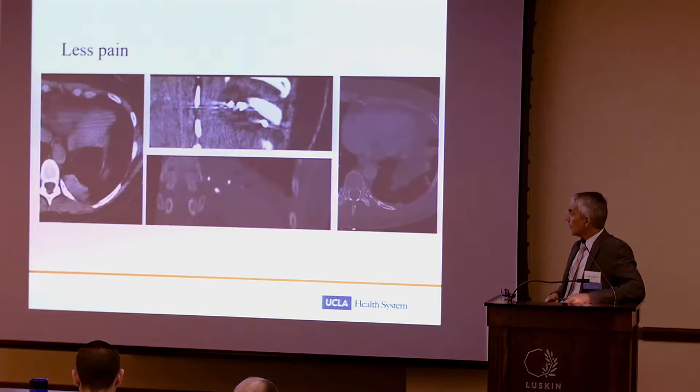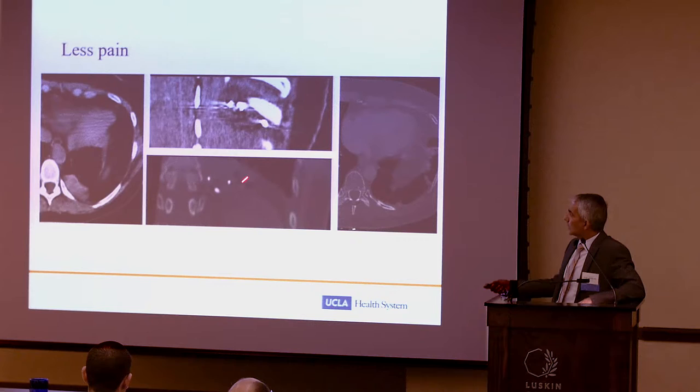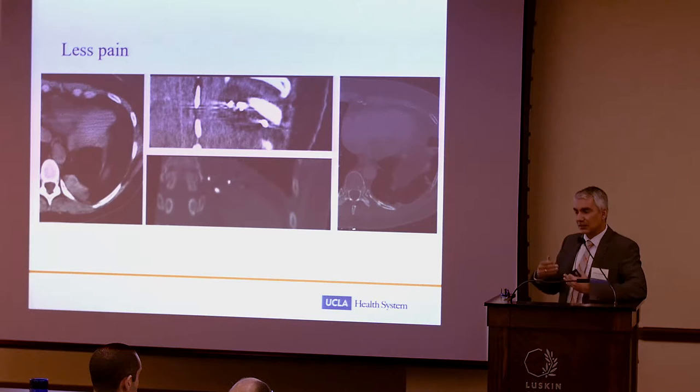This is an example. Here's a tumor you can see in the periphery. It's a common site of recurrent tumor, next to the aorta, next to the spine here. We dare not put probes to try to burn this, because that collateral injury can cause spinal cord injury, pain. The chest wall can burn out. But with cryo, that wasn't the case. You can really control the amount of ice ball, and you know exactly when it gets close to the spinal cord. We place three probes. You can see these three probes here. This is an ice ball, and the advantage of the ice ball, again, is you can actually see it. You see where the ice ball is going in the tissue.